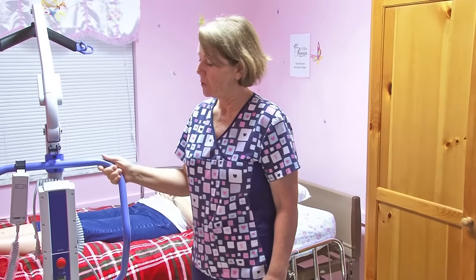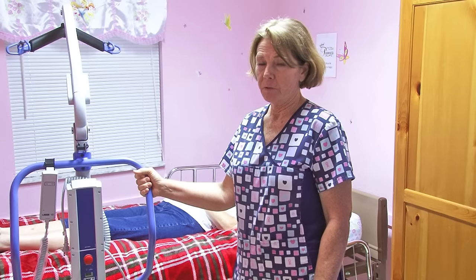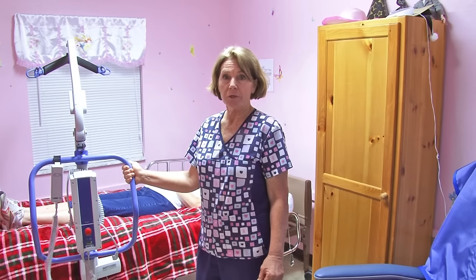Hello, my name is Trina Romeo. I work in the Health Services Department and do a lot of the training. I will assist with the Hoyer Lift procedure. This is the Hoyer Lift. It will assist us with getting the patient out of the bed and into either a Jerry chair, a shower chair, or a wheelchair.